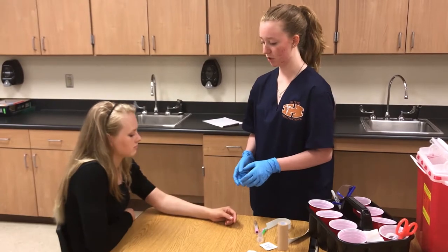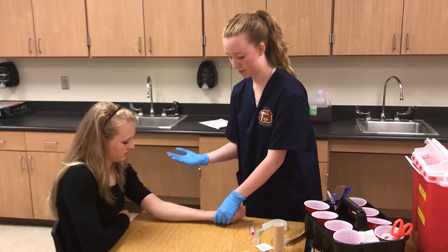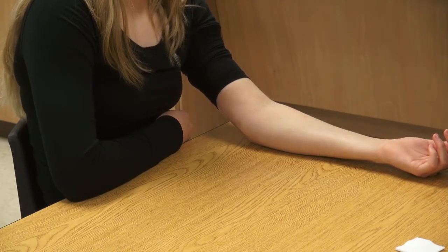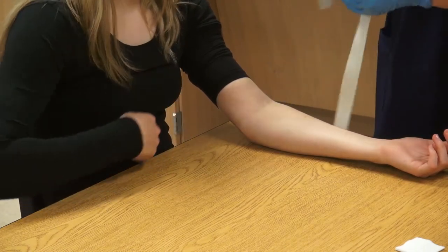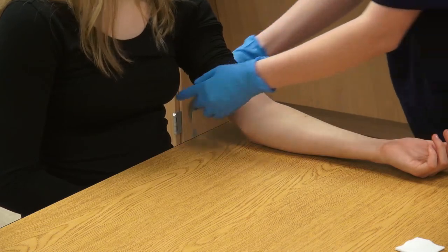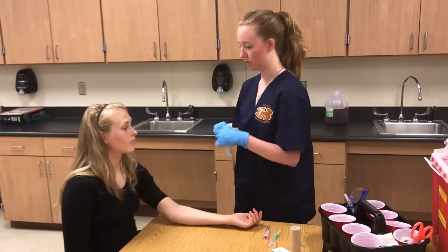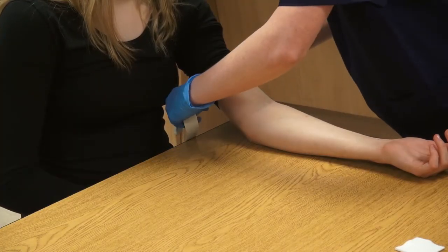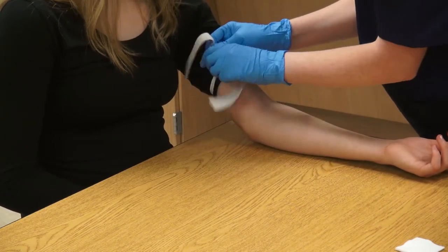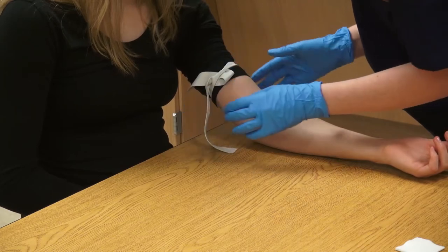Then ask the patient or move their hand to put their arm in a supine position with their vein facing up. Next, acquire your tourniquet and apply it. If the patient is wearing a long sleeve or has a latex allergy, you can put the tourniquet over their sleeve. Make sure to ask if the tourniquet is too tight. 'Is it too tight?' 'No.'